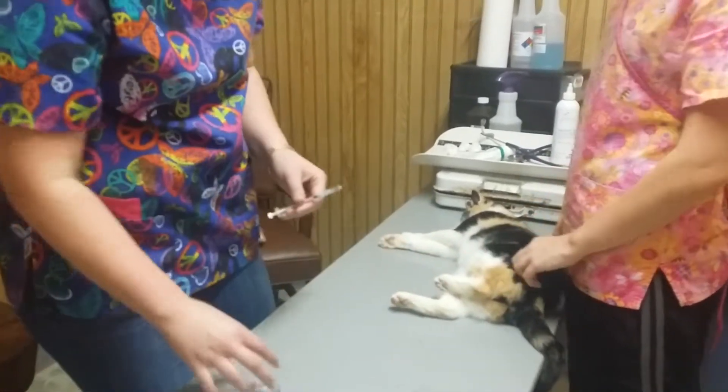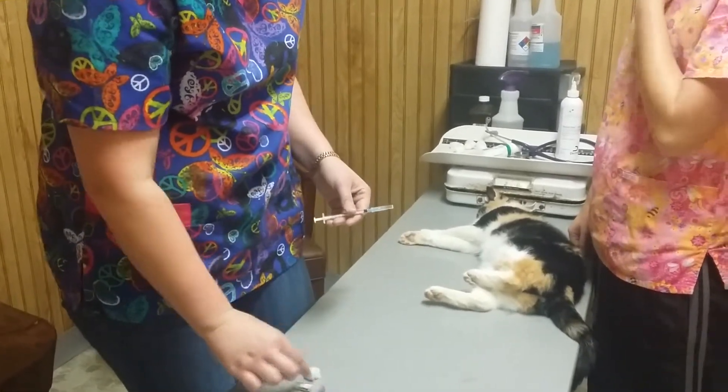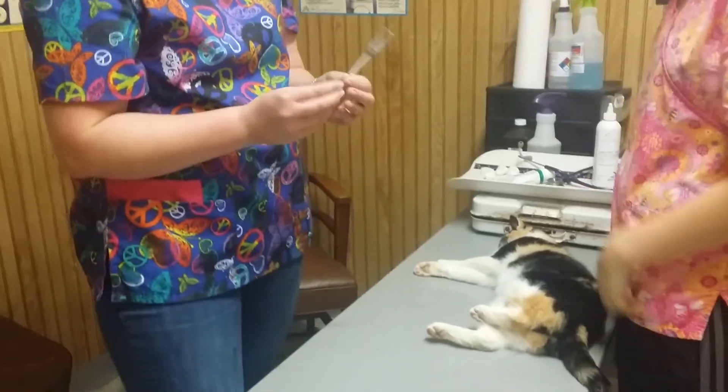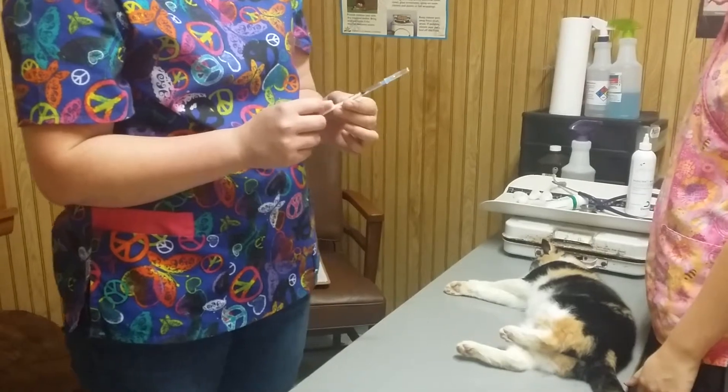First thing I'm going to do is make sure I have the correct tools. I have my properly labeled blood tube, my alcohol, my cotton ball with alcohol on it. I'm going to make sure that I have the proper size needle and syringe, and I'm going to break my seal.